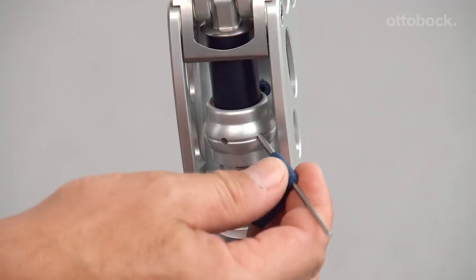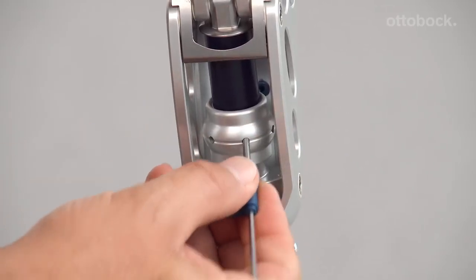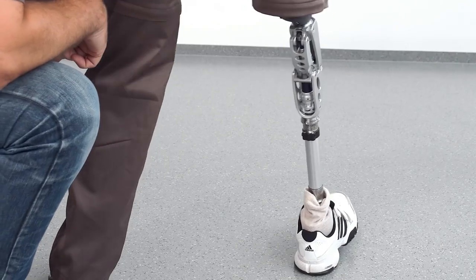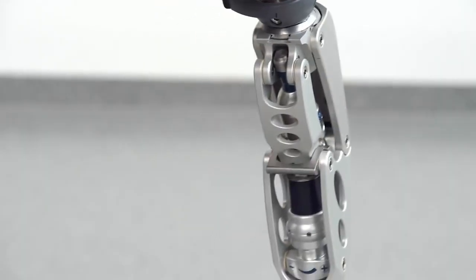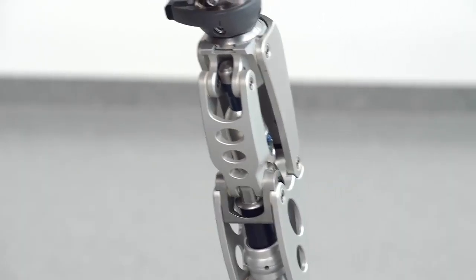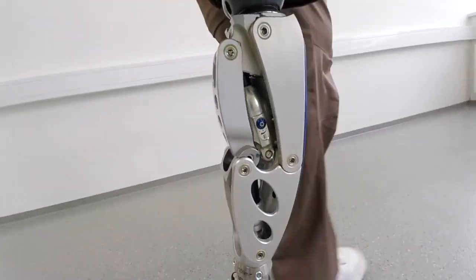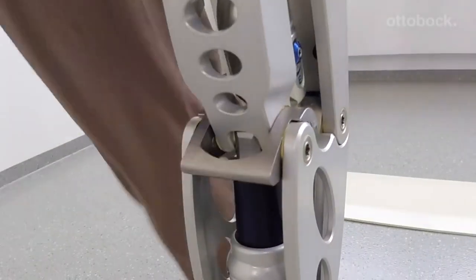If the resistance of the EBS unit is decreased, more knee flexion is possible and the pivoting mount raises faster. The round spring of the EBS unit must be adjusted so that the pivoting mount does not permanently stay in the end position. Please compress the EBS unit a bit more so that the user experiences increased comfort at heel strike and targeted control of the stance flexion.